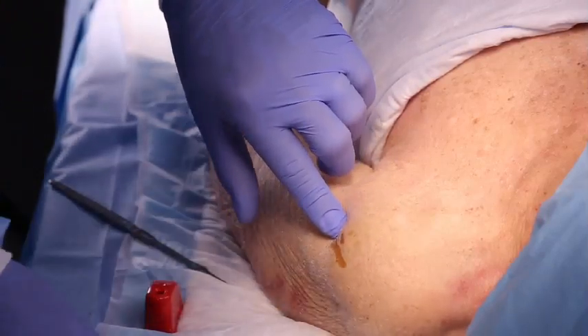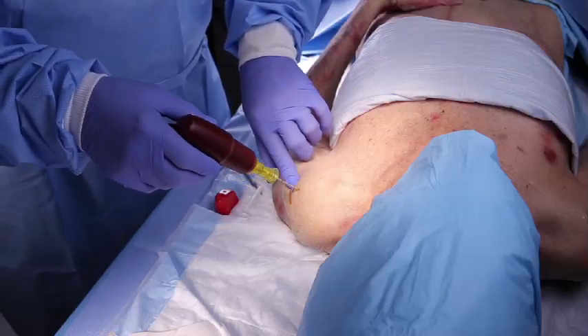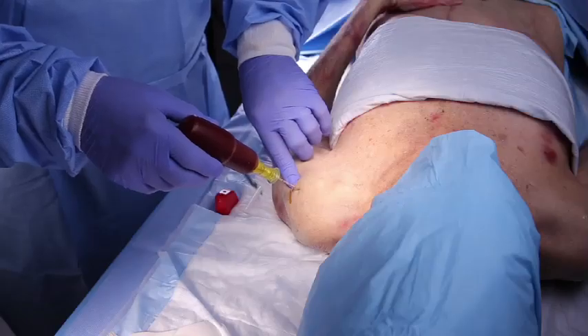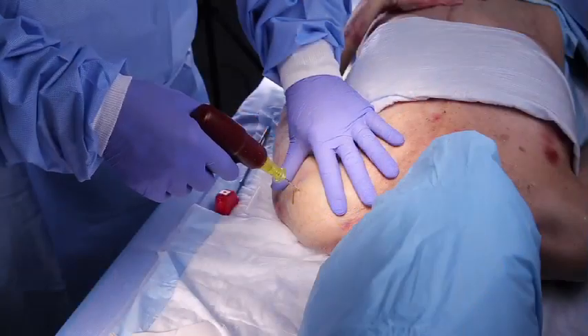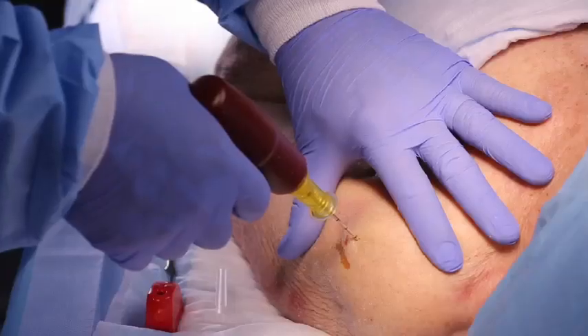Remove the needle cap. Point the needle set tip at a 45 degree angle to the anterior plane and posterior medial. Push the needle tip through the skin until the tip rests against the bone. The 5 mm mark must be visible above the skin for confirmation of adequate needle length. Drill gently into the humerus 2 cm or until the hub reaches the skin in an adult.